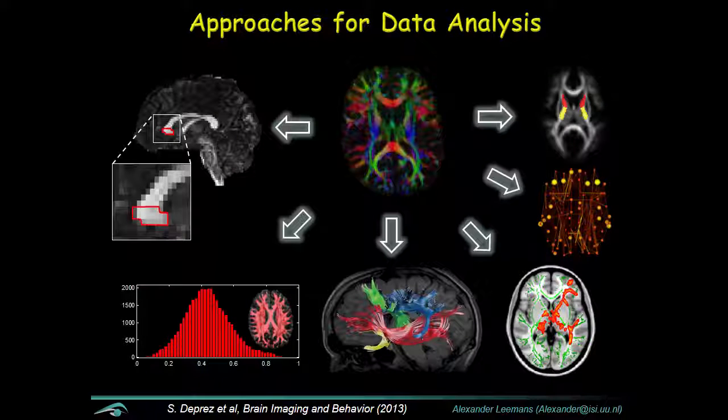Okay, that was a quick intermezzo on DTI being already a good model for some applications. And then there's all the different analysis approaches, and there's many. You can look at a single voxel. If you, for instance, register your diffusion data to a T1 map and you annotate a region on a T1, because you may be very familiar with locations in a T1, then you can extract the diffusivity values. That's vanilla analysis, if you want. Okay, it's very simple, but it works.